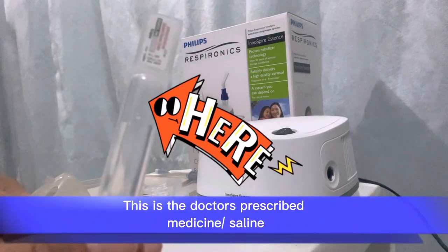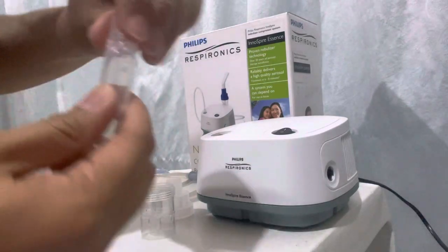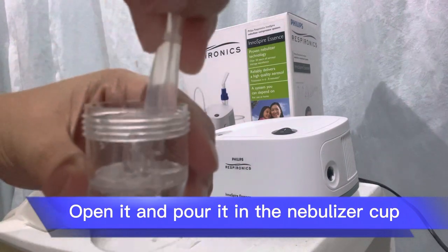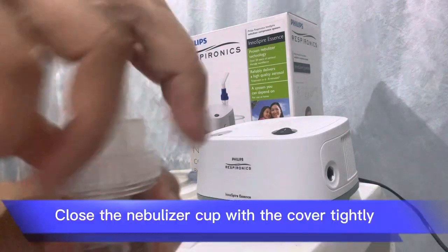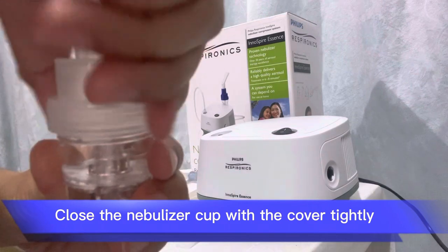This is the doctor's prescribed medicine or saline. Open it and pour it into the nebulizer cup. Close the nebulizer cup with the cover tightly.